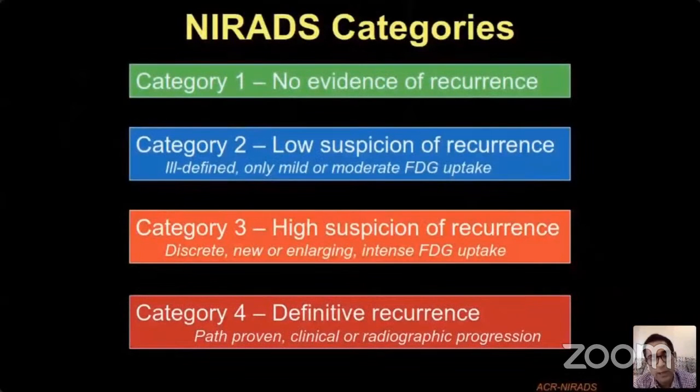Let's look at the post-therapy imaging. Post-therapy imaging, we in our center now follow NI-RADS categories. It's beyond the purview of this particular presentation, but just to highlight that we report using NI-RADS, and NI-RADS category 2, which is very important because it's a submucosal disease usually seen in the tongue, should be kept in mind. Primary imaging after surgery is done by MRI at 6 months, and if there is a suspicion, you supplement your imaging with PET-CT.